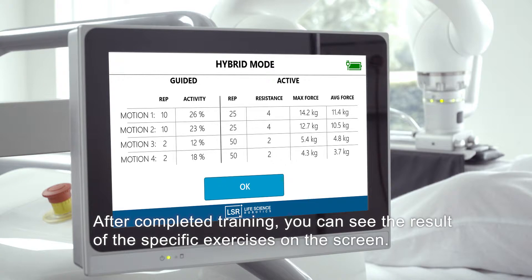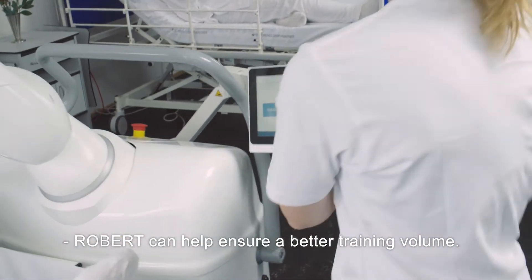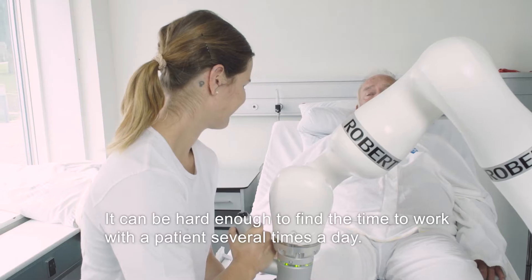After completing training, you can see the results of the specific exercises on the screen. Robert can help ensure a better volume of training, as it can be difficult to reach a patient several times a day.